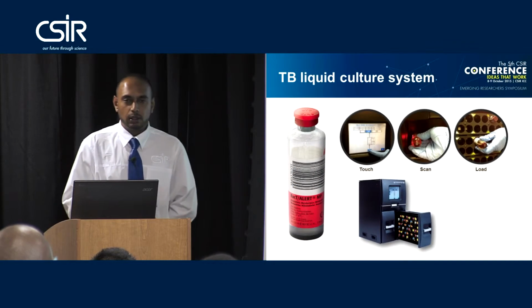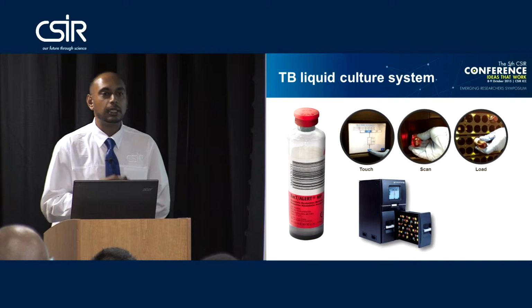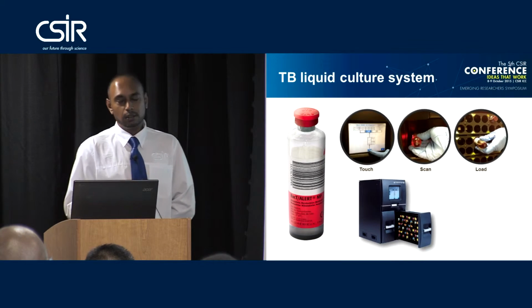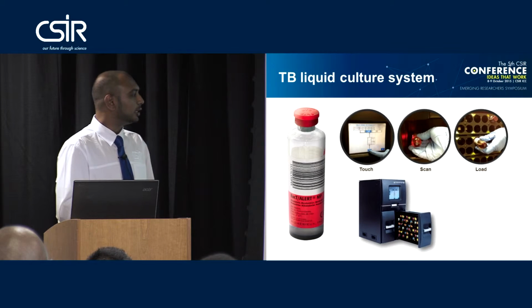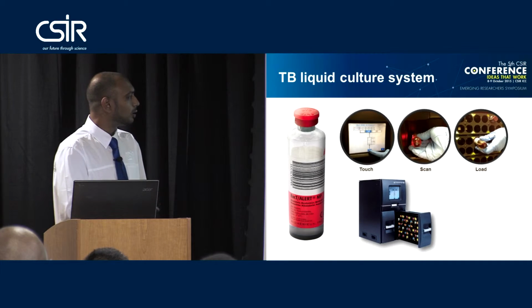So just to touch on how it's performed in the laboratory when a patient's sample is submitted, yes, we perform the light microscopy, but what also needs to be done is a TB culture, liquid culture these days, after which the identification, as I've said, and drug susceptibility testing. So this is how it looks in the laboratory, the TB culture liquid system.